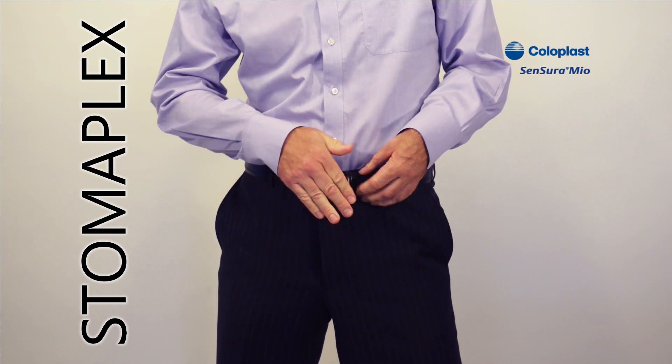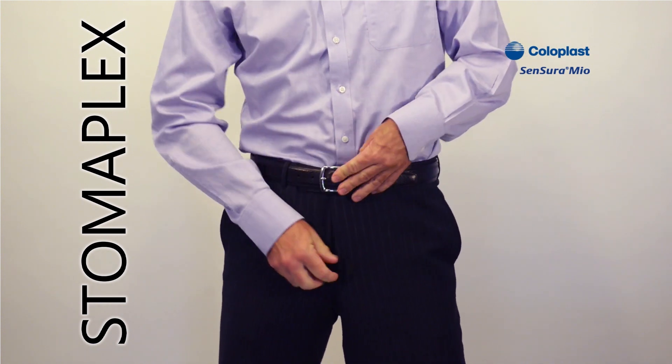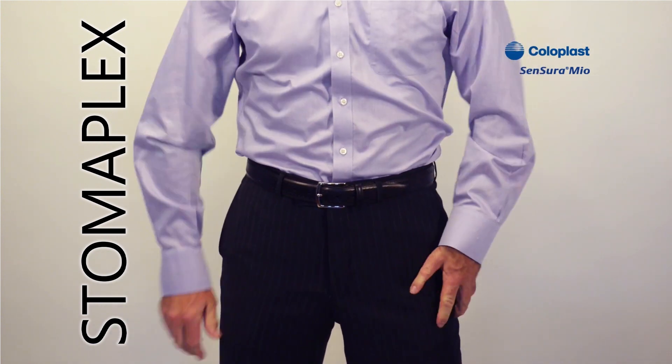You can tighten the belt very tightly, and you're all set to go.